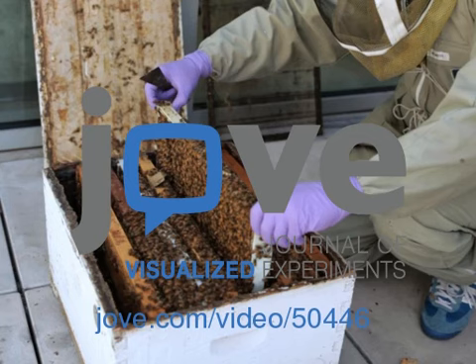Observe bees for 3 to 5 seconds after injections. If a hemolymph droplet leaks from the wound, discard the bee. Mark the thoraces of the bees with different colors corresponding to different treatments. At this point, if the single injection strategy is being used, observe the bees for 1 hour in a container with honey supplied, then place them back into a colony.